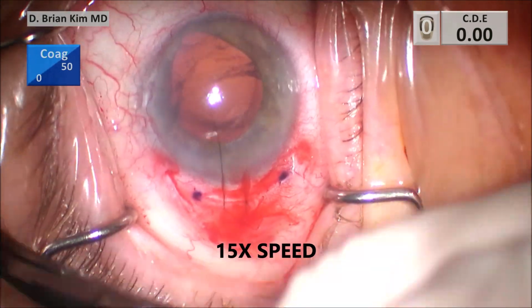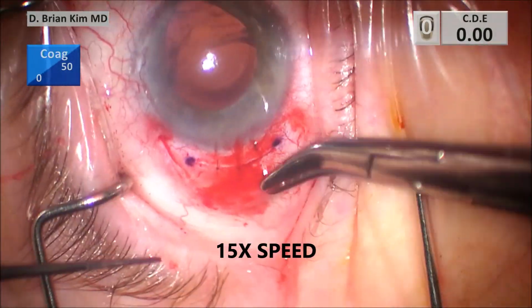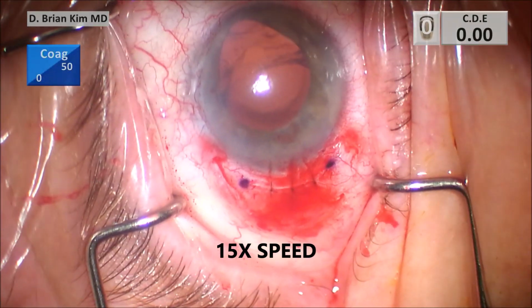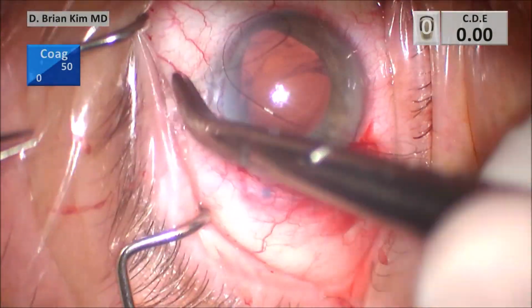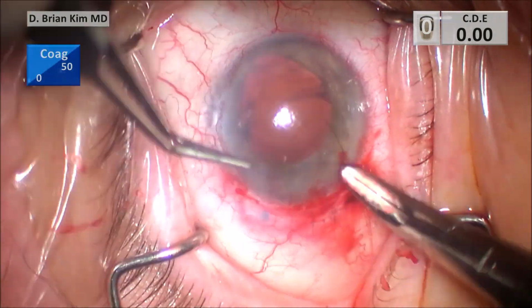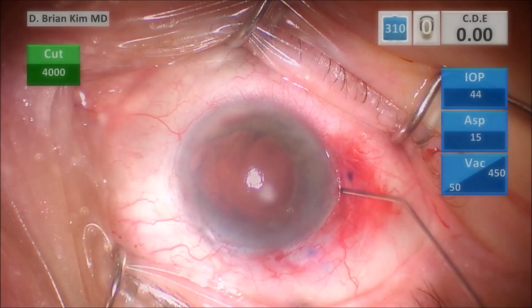I don't really think it's wise. It's a big incision, and I feel confident to execute the Yamane through a limbal incision, and I'm able to place the sutures through, again, that's 10 nylon times 3, and then I'm closing the conjunctiva as well. And so I'm basically trying to do this surgery in a staged manner, and I did the removal of the lens, and then now I'm going to execute the Yamane technique.